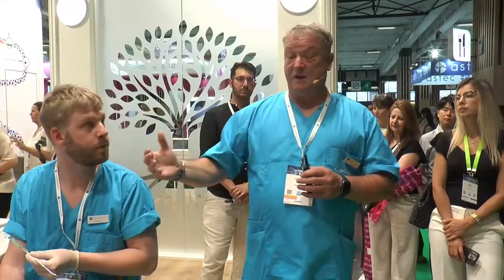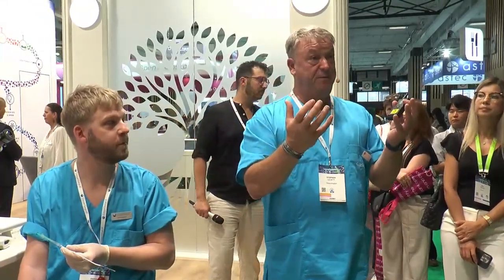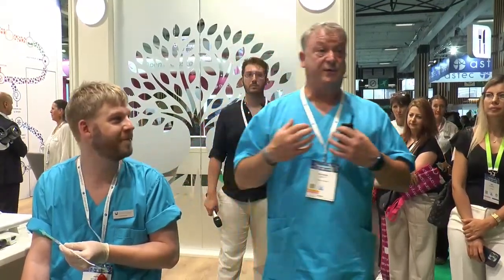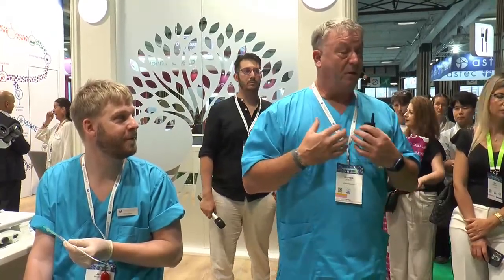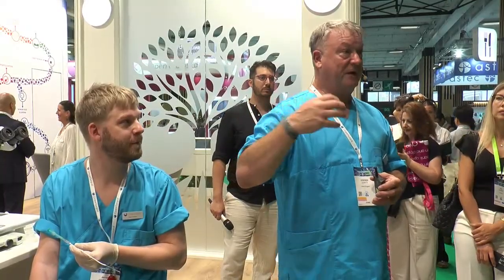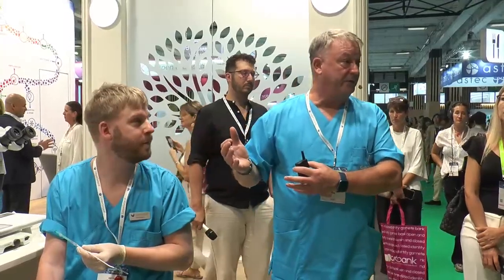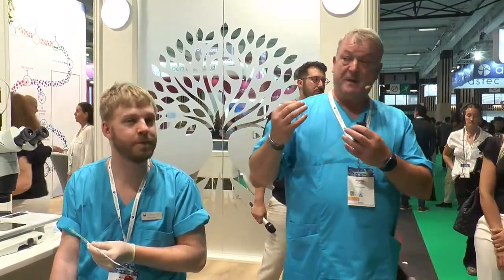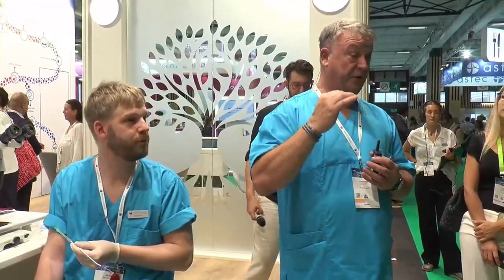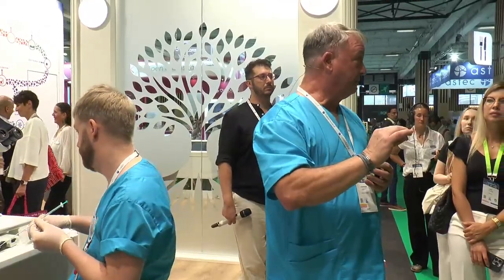So it could say, if Anton and I are clinicians doing embryo transfer, I pick the same patient group, and Anton has a 50% pregnancy rate, I have a 30% pregnancy rate. Now, what does that tell me? I've ruled out patient variability. It says I probably need a little bit of help to be as good as Anton at doing embryo transfer. So we know practitioner variability is a true thing, and so training in embryo transfer is extremely important.